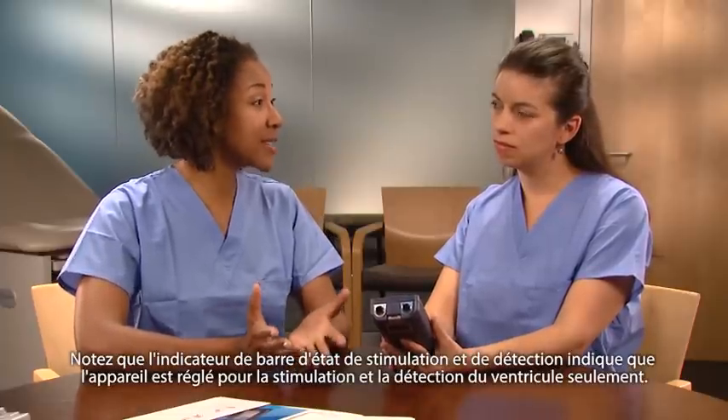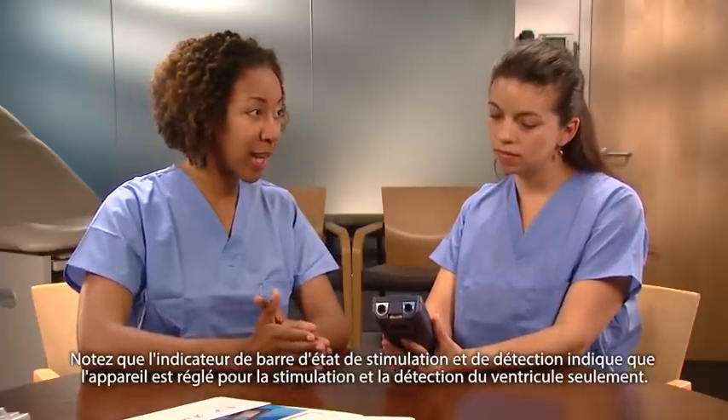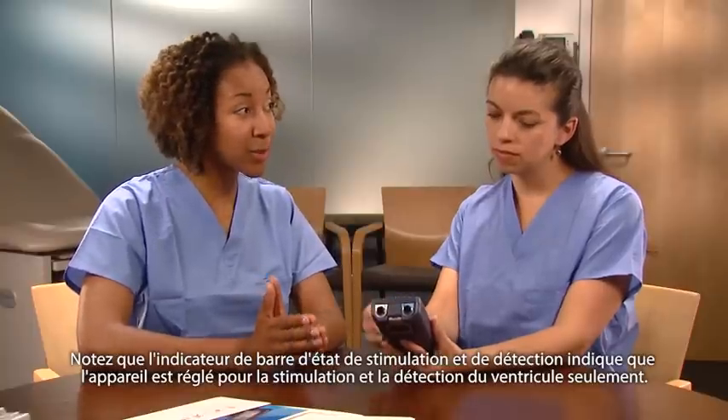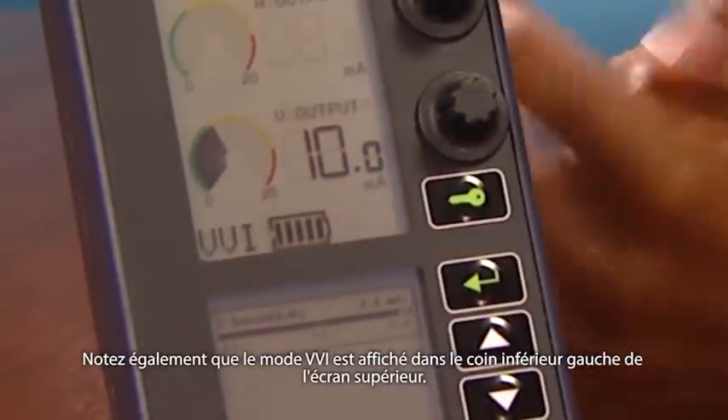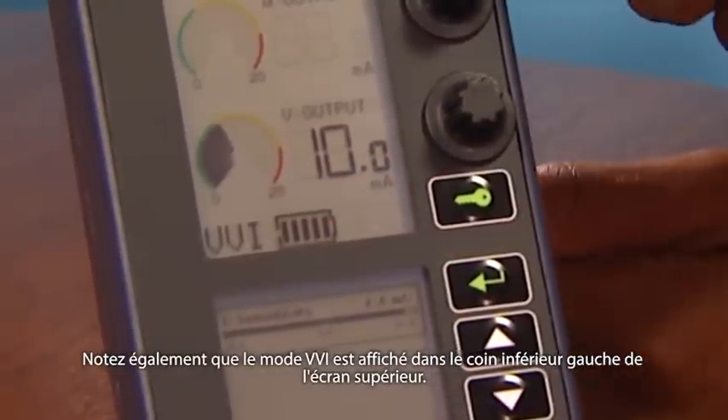Notice that the pacing and sensing status bar indicator shows the device is now set to pace and sense the ventricle only. Also notice that in the lower left corner of the upper screen, the mode is VVI.